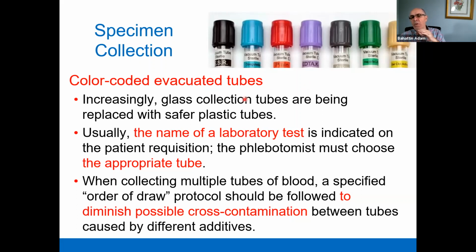If you know which test is requested and which test tube you are going to use, it is not a big deal. You will learn this before you withdraw blood.